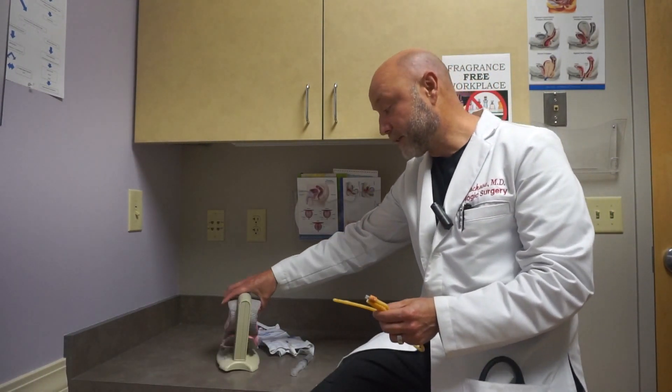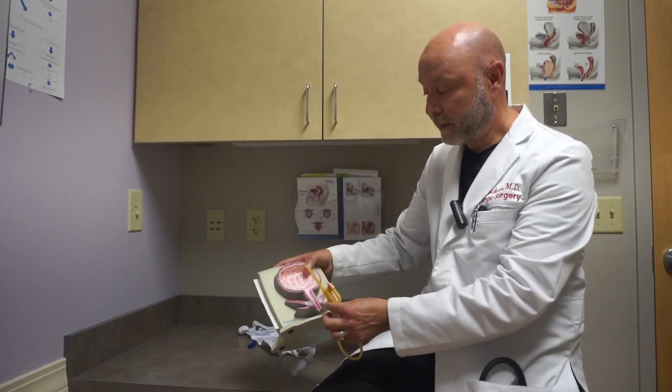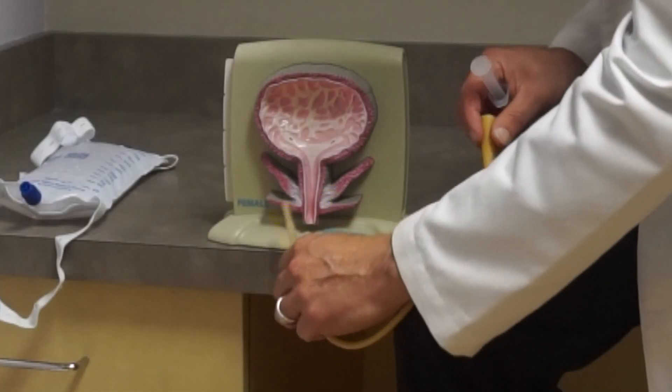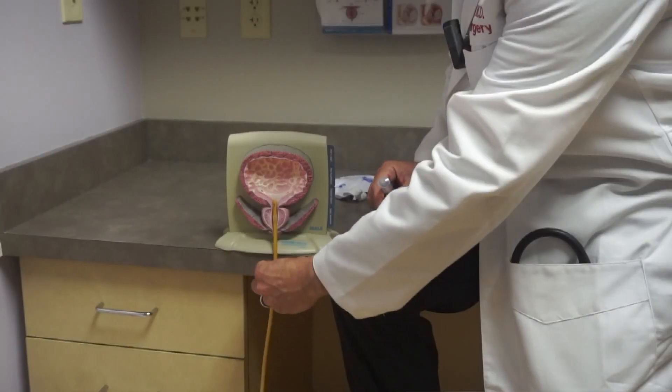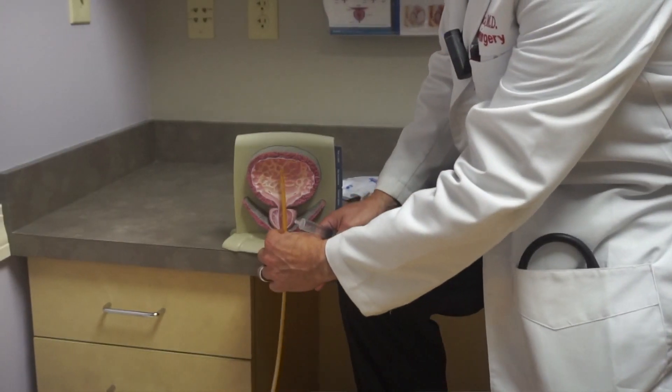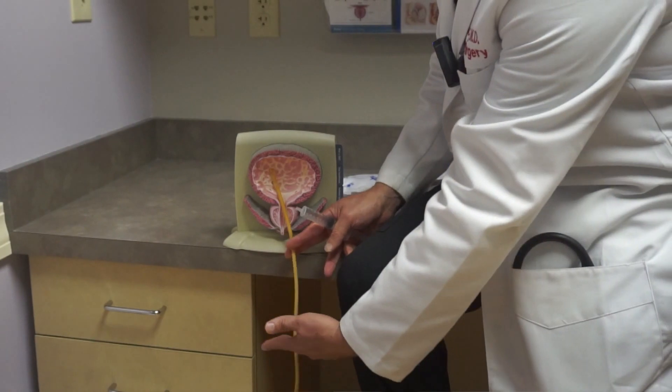For instance, if we would put this in a man who we deem needing help with emptying the bladder, it would be sitting in the bladder something like this, and it would be coming out the tip of the penis sort of like this.